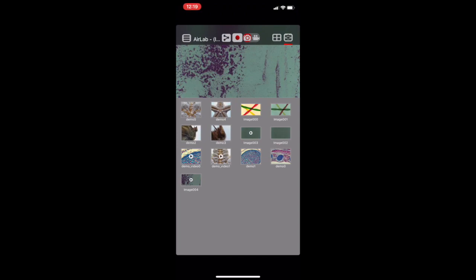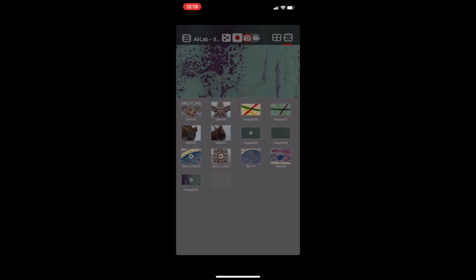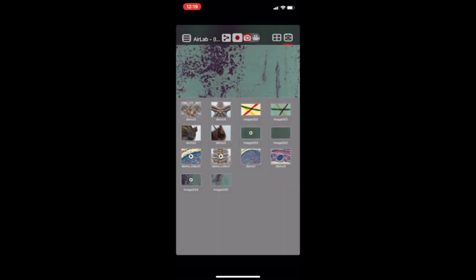To capture a photo, you're going to click the red button at the top of the screen, then select which magnification to use and capture. To save to your phone, we recommend taking a screenshot of the image and editing it in your album.